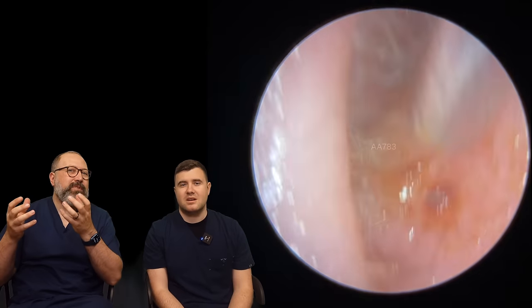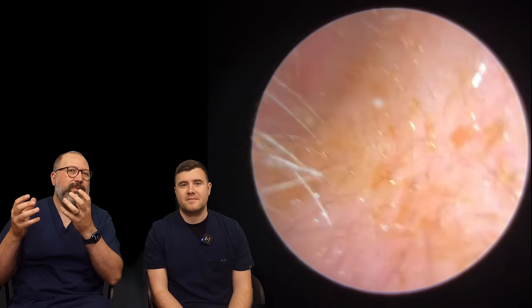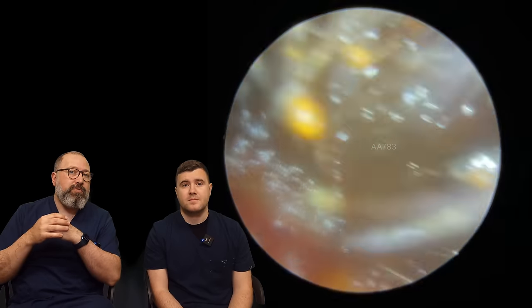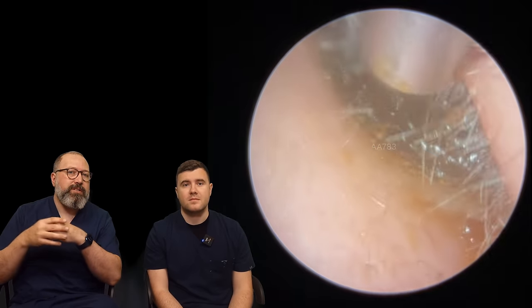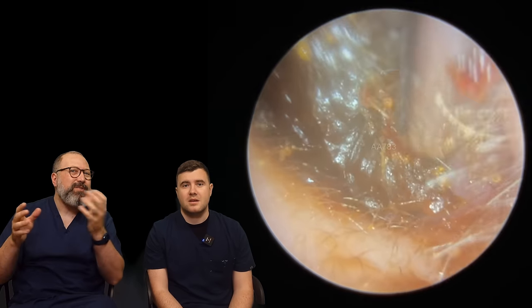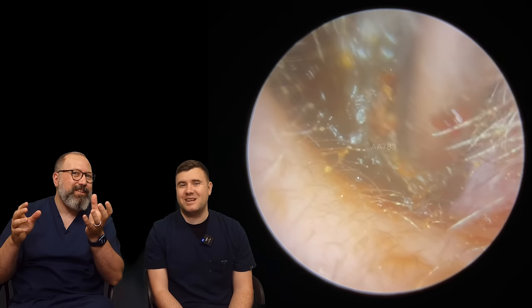It tends to pull everything that's further back with it as well. With the Jobson Horne, it's nice when it does that — when you get that little bit of purchase you can see all those deeper sections coming forward. We talked yesterday about these ear canals that slope up, and now you can see that really prominent slope up towards the eardrum. Very similar story on this side as well — so this is still my patient, this is just the other ear canal. We're going to try and detach now.